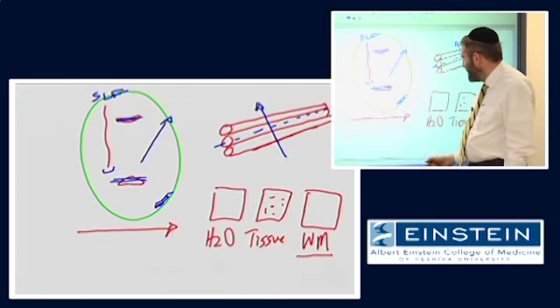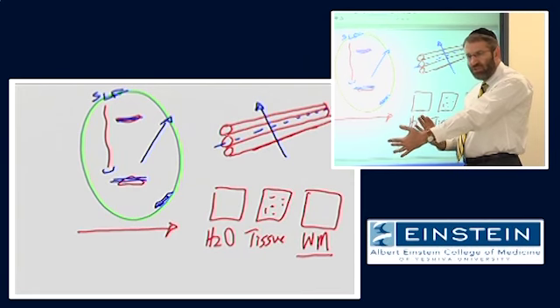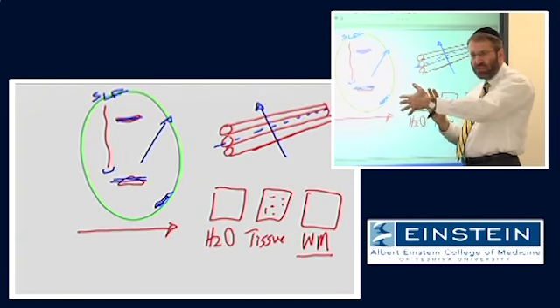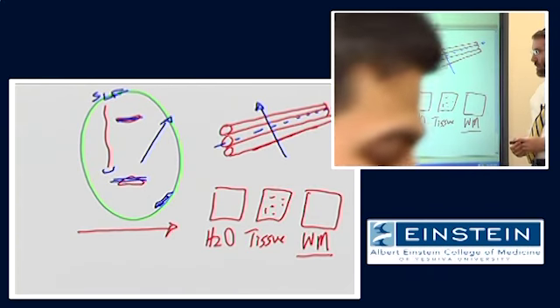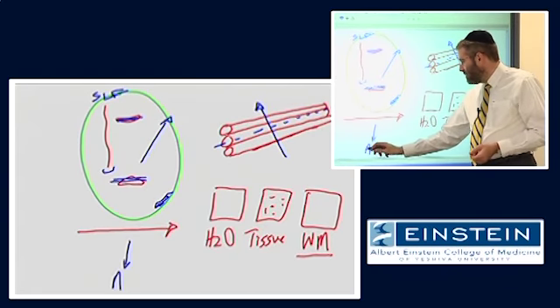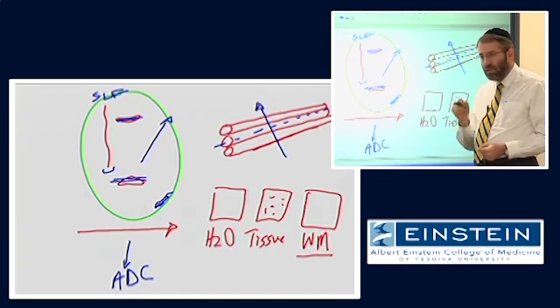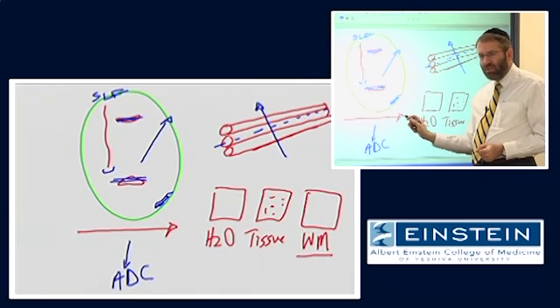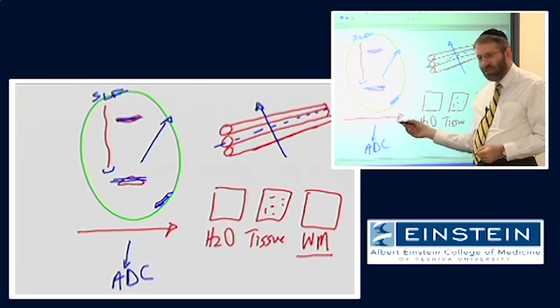So in this example, I should qualify it, assuming we have a B0 image to which we can compare this, we can make the same quantification of velocity as we do with our other diffusion-weighted image. And that's exactly what we'll do. From this, we will derive an ADC image, which is telling us about, in each voxel, no longer the speed, but the velocity of diffusion at each voxel, or the component of velocity parallel to this diffusion sensitizing gradient.